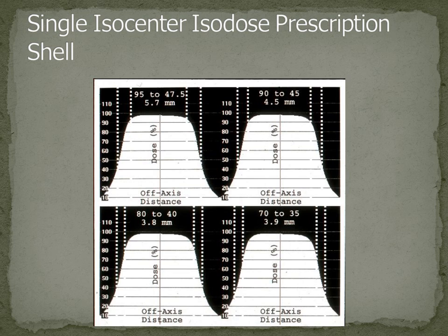The reason why we do sphere packing is that as you look at the next couple of slides, you realize that these spheres of dose have this nice intensity profile, this nice property. If I align my spheres of dose with the edge of the target, I am guaranteed to have this steep dose gradient at my interface between my target and my normal tissues.